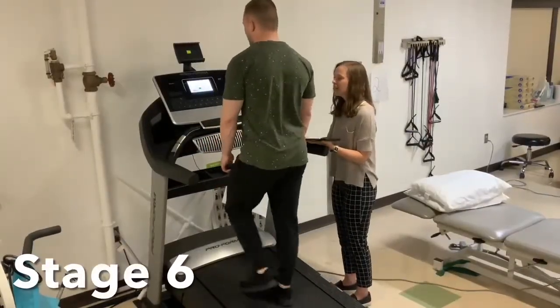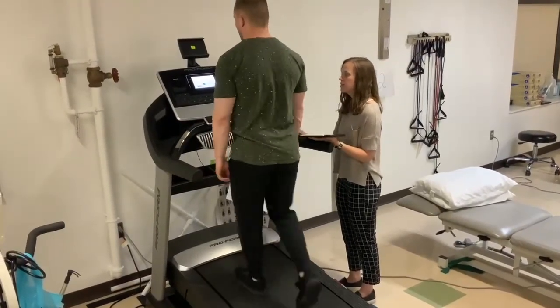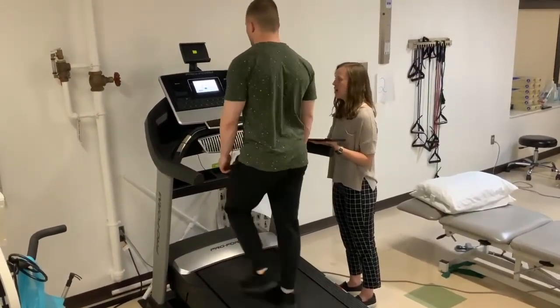Okay, so we're in stage 6, the last stage. You're at 12 incline, and we bumped up the speed to 2 miles per hour. And do this for another 2 minutes.